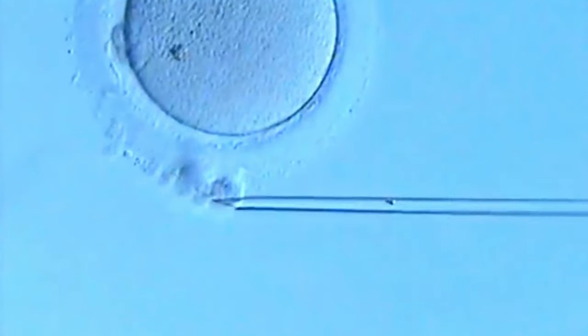This is a great video about ICSI, intracytoplasmic sperm injection. And what you see here is they're getting the sperm ready and they nick the tail, and now they're pulling the sperm into the device that will inject it into the egg.